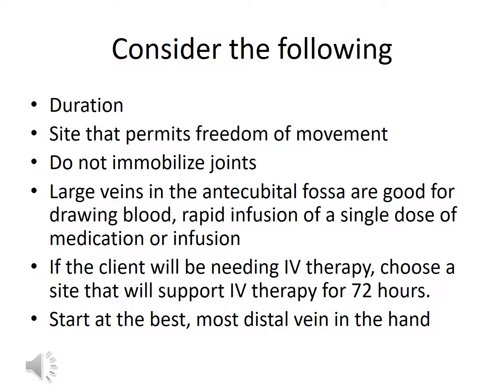With IV therapy, you also want to consider the duration. How long are we going to leave this IV in? The site: does the site permit freedom of movement for the patient? Do not immobilize the joints. Large veins in the antecubital fossa are good for drawing blood and for rapid infusion of a single dose of medication. So at the bend of the elbow, you want to try not to use that if at all possible.